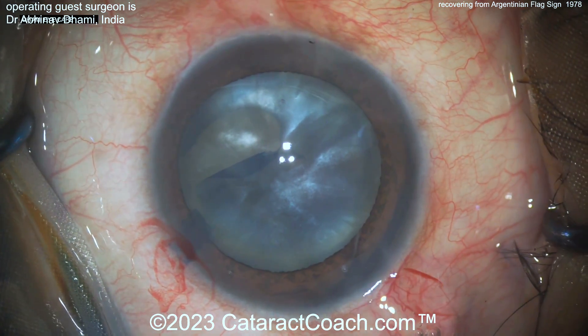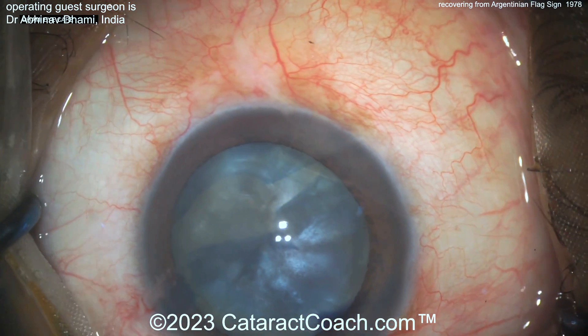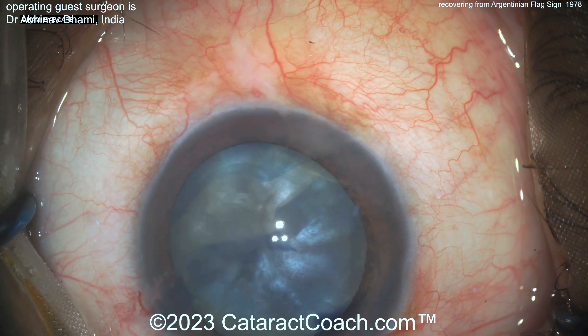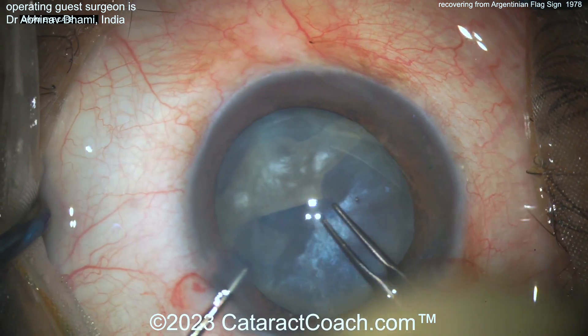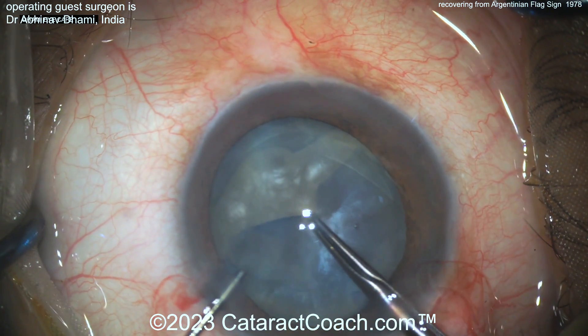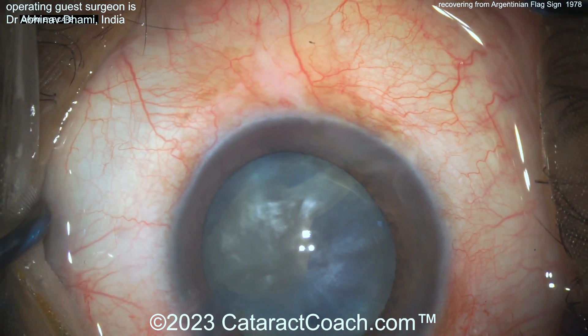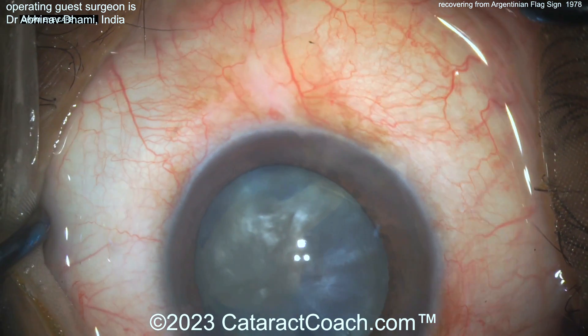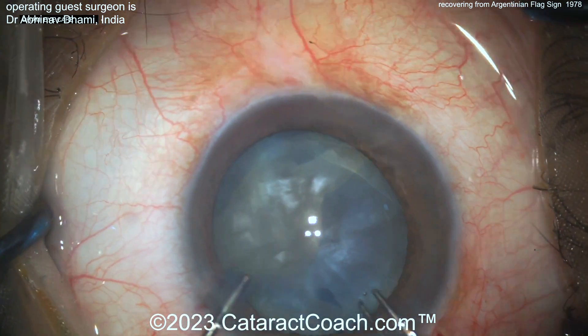Now what? A surgeon is going to make a nick in the capsule and try to go the other way — and it runs out again. Sometimes you just can't win. We didn't fix the main problem: you have to decompress the capsular bag. When you feel the anterior lens capsule so pressurized, you know you have an intumescent case where the intralenticular pressure is very high.